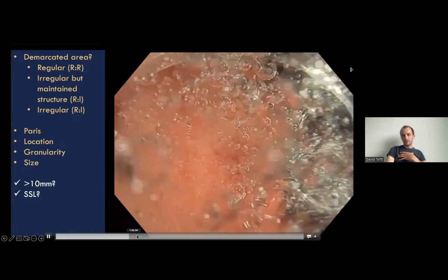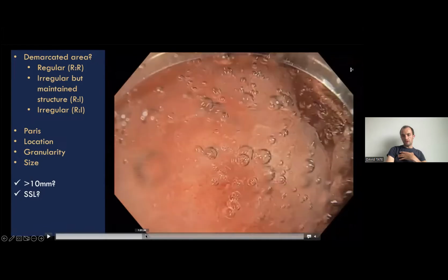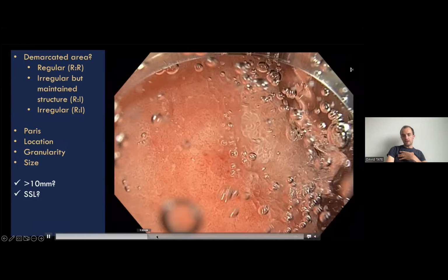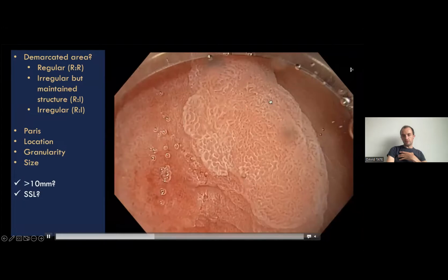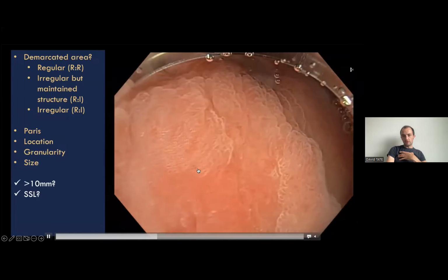So we can use water for that. You can use water and a cap if you're not sure. And here we see it. So now we start to see it nicely with white light. And then as you go in closer, maybe you can clearly see the edge of the normal looking polyp. So this certainly would be a regular structure. And then here you can see the abnormal area.